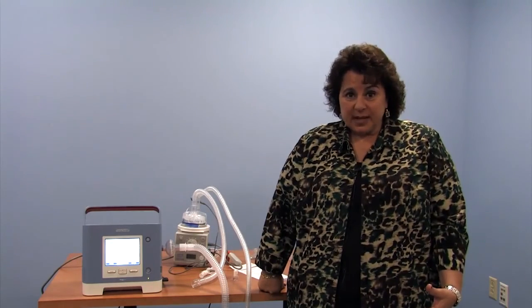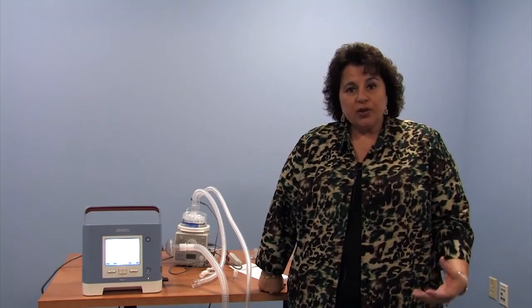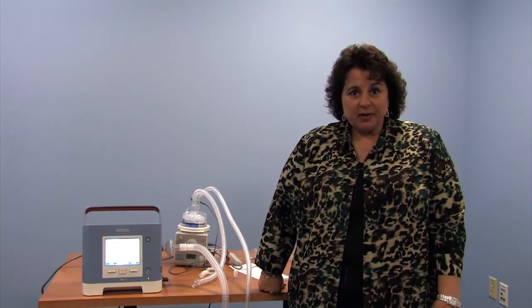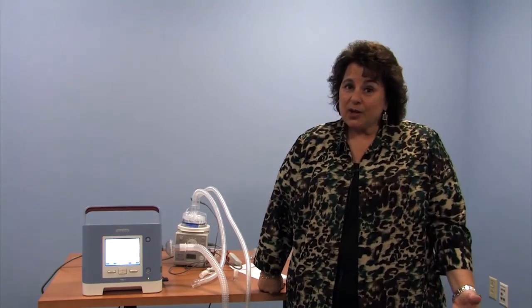Remember, there are many different types of circuitry, pediatric and adult, heated and non-heated, so determine what's best for your child. When using a mask, you do not necessarily need the heated humidifier. In the adult world, people tell us they don't like the hot air. So your child may not be able to voice that to you, but may not like the hot air.